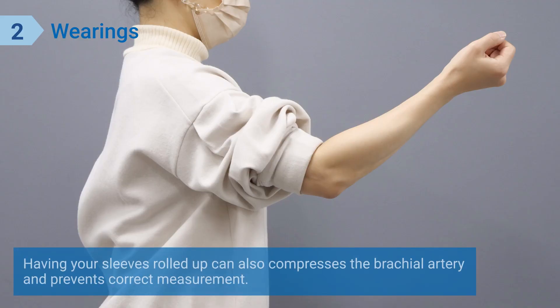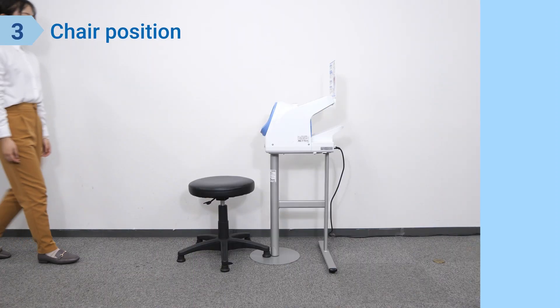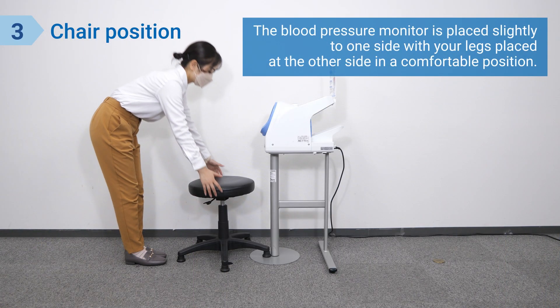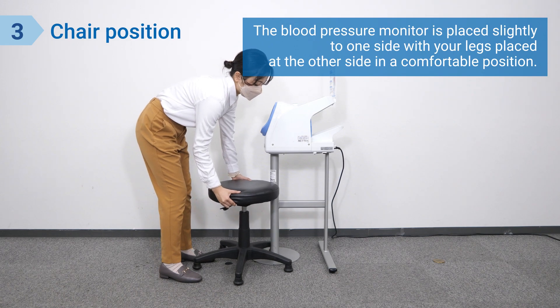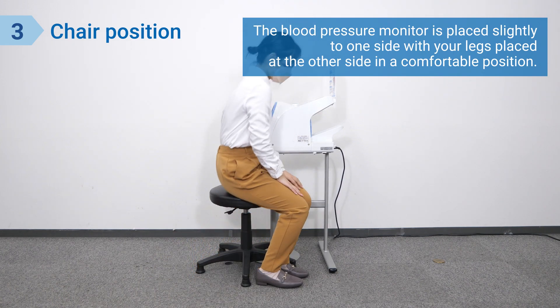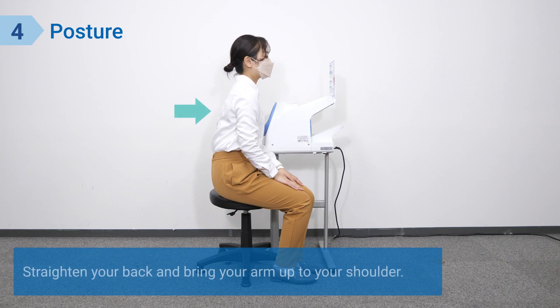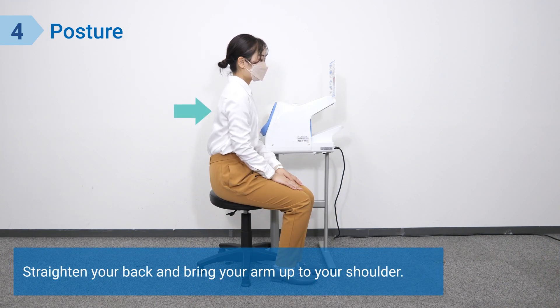Having your sleeves rolled up can also compress the brachial artery and prevent correct measurement. The blood pressure monitor is placed slightly to one side, with your legs placed at the other side in a comfortable position. Measurement can be taken with either the left or right upper arm. Straighten your back and bring your arm up to your shoulder.